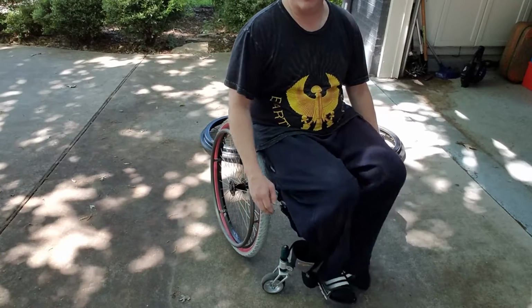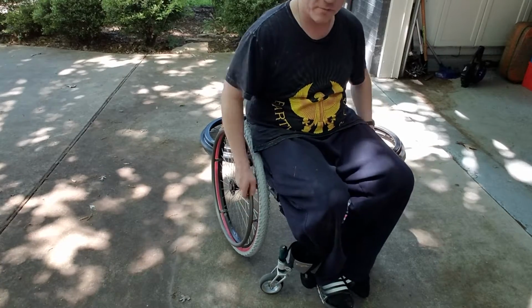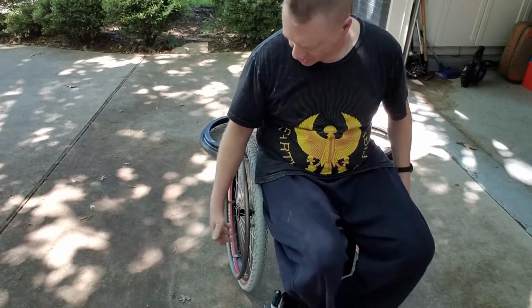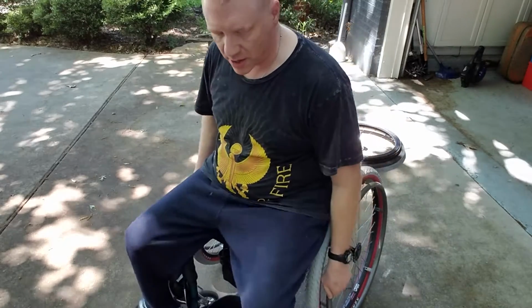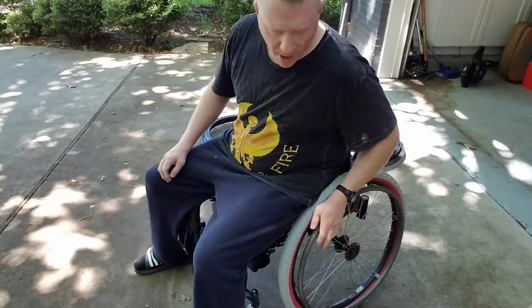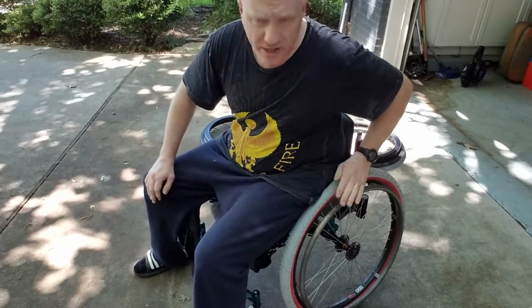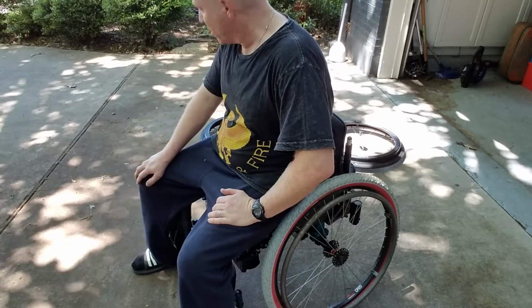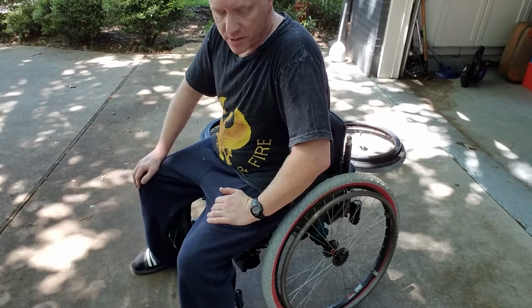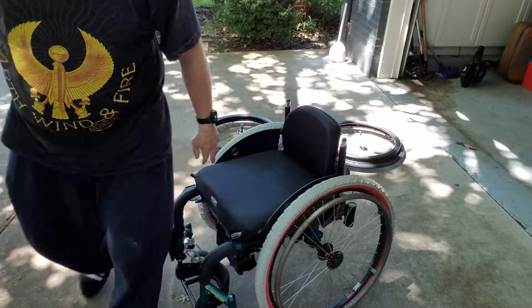I don't use a wheelchair, so I can't really speak to the difference in terms of use, but I'm sure this is designed to facilitate doing stuff on an unpaved surface or whatever. In our experience, we didn't really use these wheels very much. The smaller wheels tended to be the ones that stayed on it most of the time.